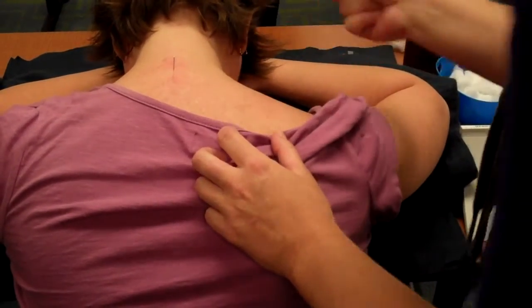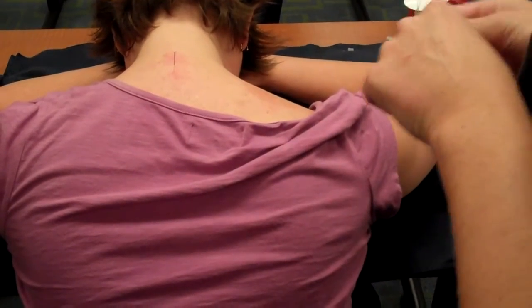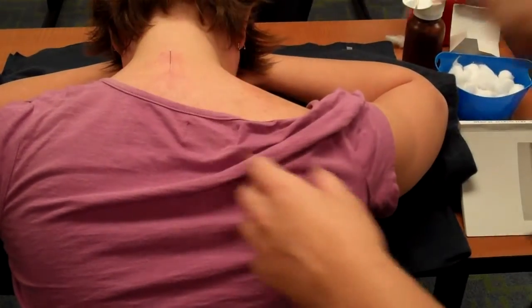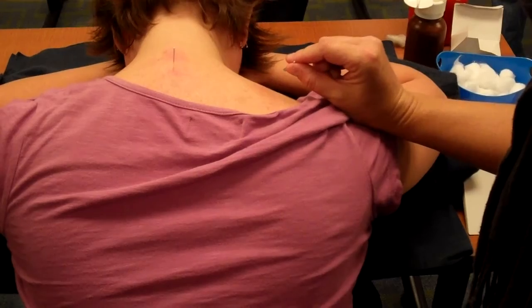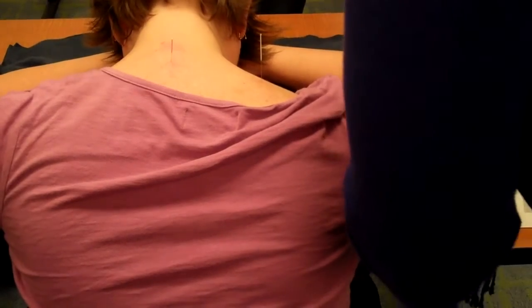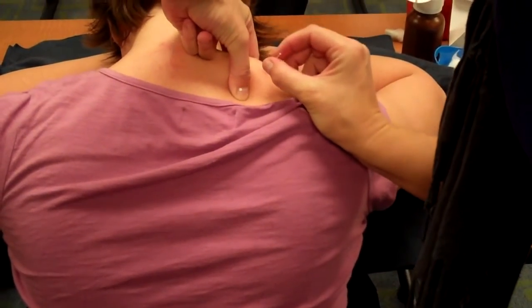You're going to swab. And then when you needle, because of the patient's position — if she was sitting up — you want to needle horizontally to the patient. So I'm going to lift the traps right up and we're going to needle horizontally.